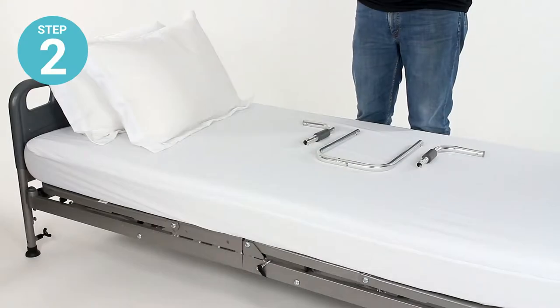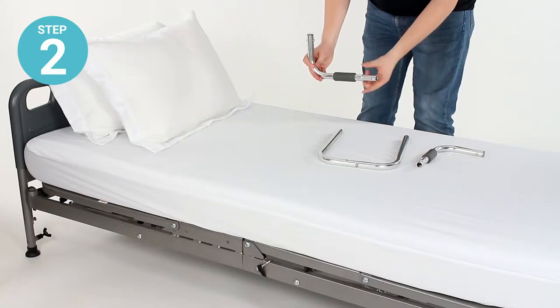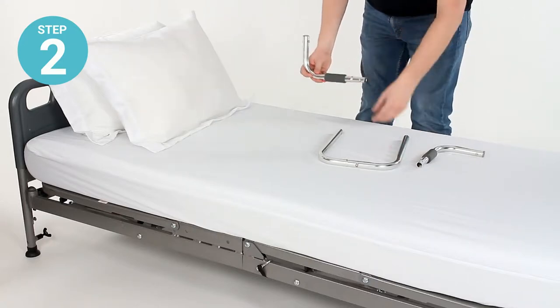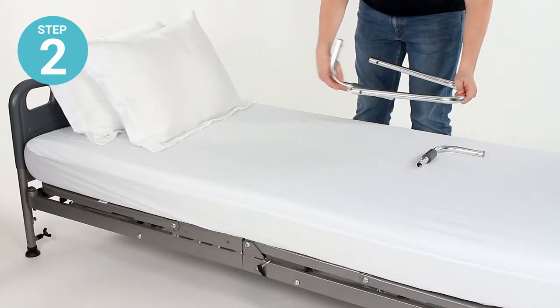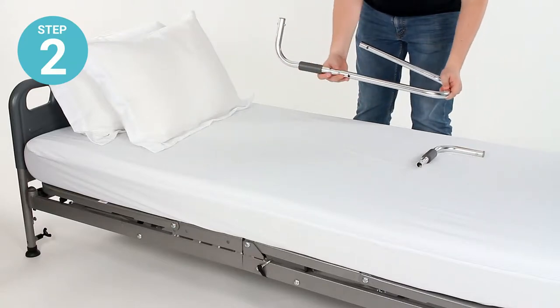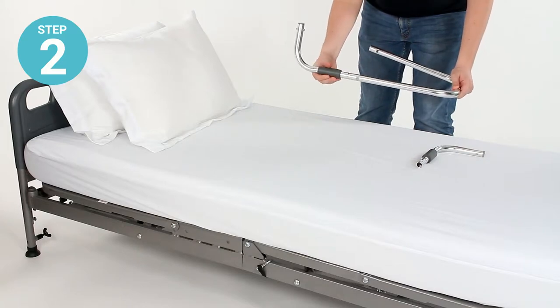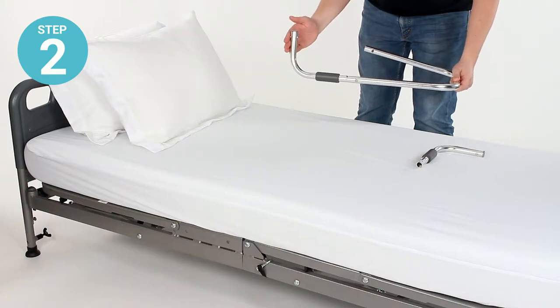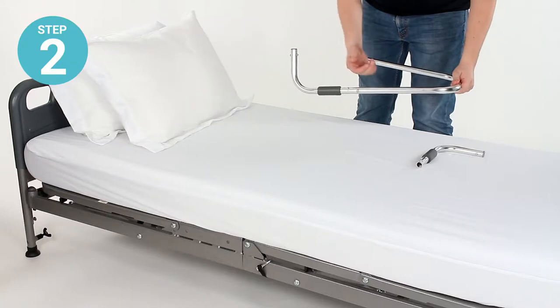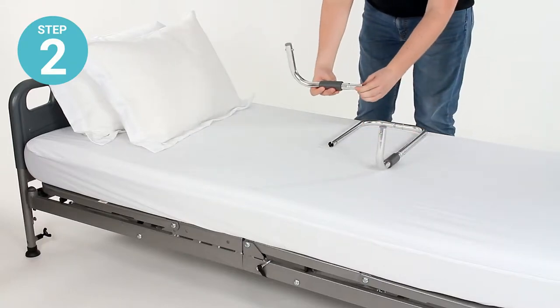Step two: fit the narrow end of the padded elbow rails into the open ends on the long base rail. As we did before, pinch the locking pins in and push together until the locking pins pop into place. You'll want the unpadded end of this curved rail to face up. Install one and then the other.